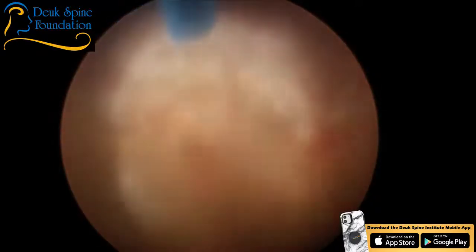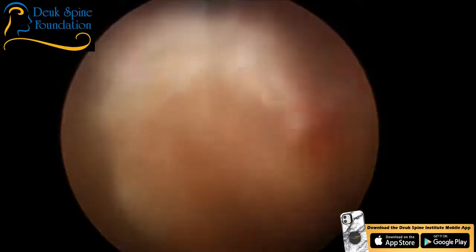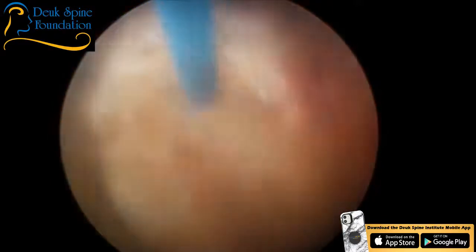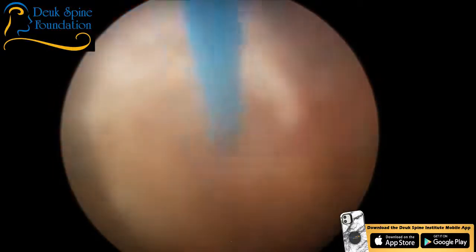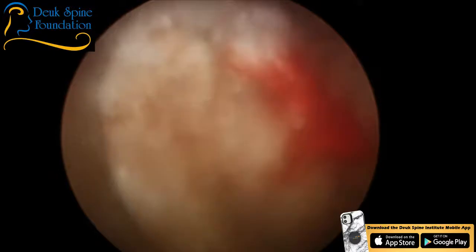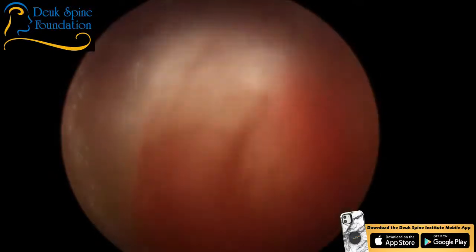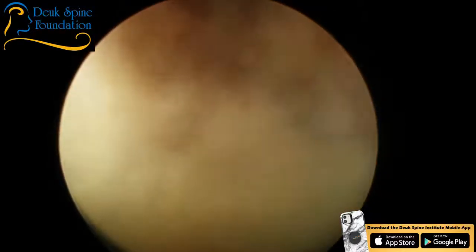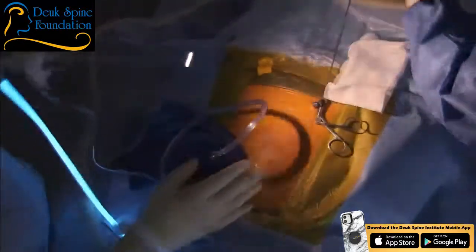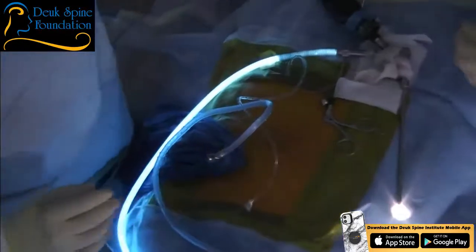Okay. 30 seconds now. Just don't want to have to come back here again. All done. Laser off. We are done. Going to suck all the water out. There it is. Scope off. Scope off. Okay.